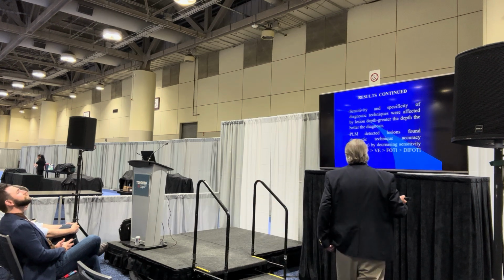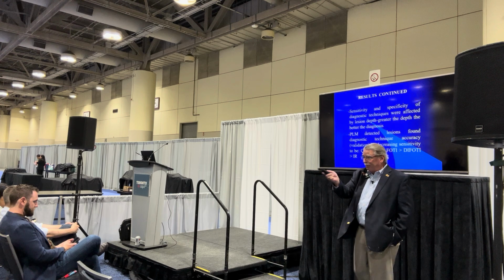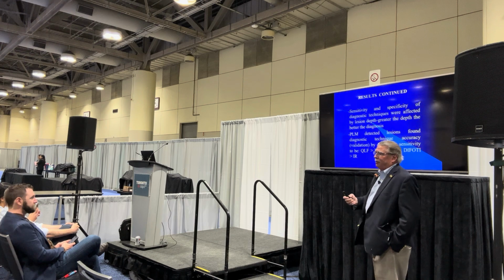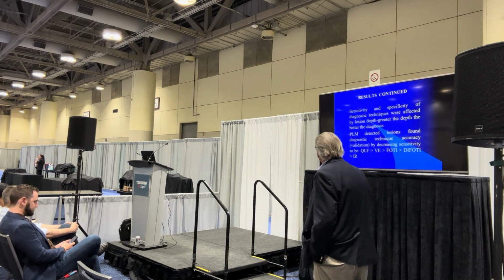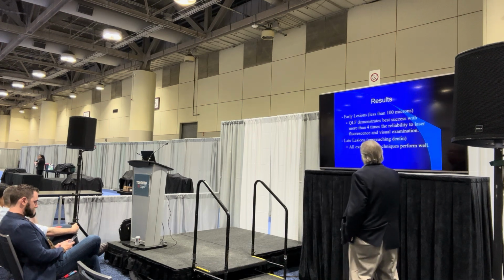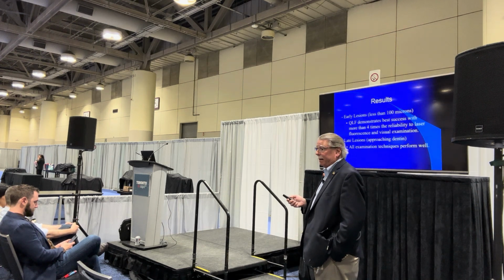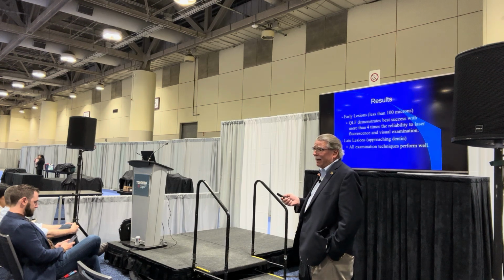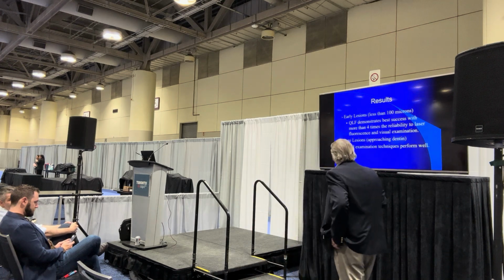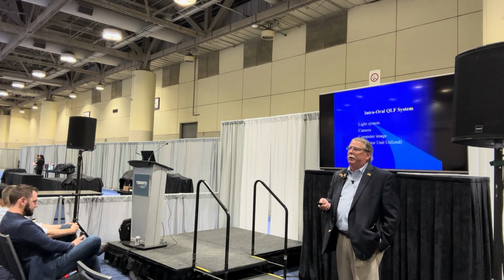So when we went through this validation, we found QLF to be the most accurate, then the visual exam, you guys, then the photo systems, and Diagnodent, the infrared laser, the least. So we could obviously, with QLF, see less than 100 microns. We later validated that we could accurately diagnose up to 50 microns. That's really shallow, guys. Really shallow. Of course, the bigger the lesion got, the better off we were. So we decided we're going to use QLF. We thought it was the most accurate.